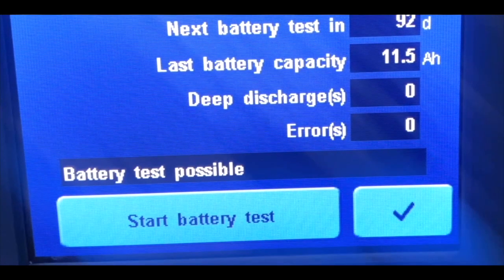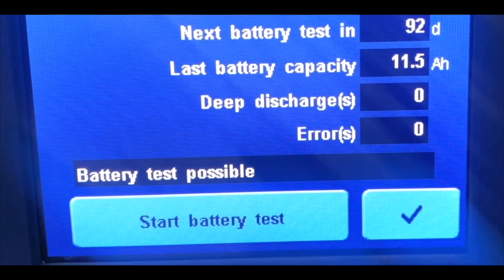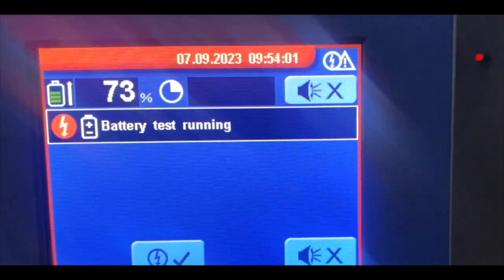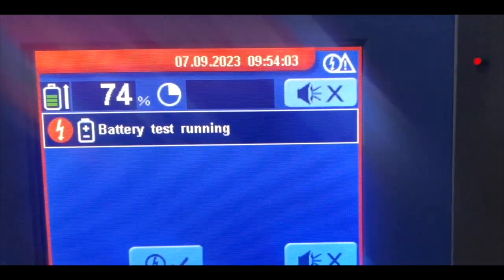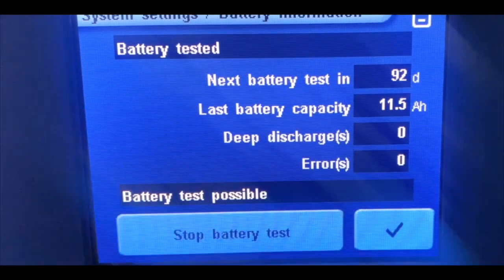You will get the option of start battery test — press on that and your heart-lung machine battery test will start automatically. Keep it for three to four hours.